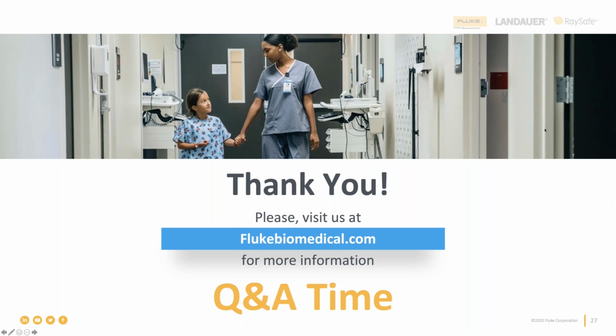The electrodes are what's actually placed on the body, right? So that's the pad with the adhesive gel. And that's really the electrode, and then the lead is what connects the electrode to the patient monitor. So it's the wire, right? So if you think about when you're doing preventive maintenance on a patient monitor, you're connecting that lead to, in our case, the ProSim, for example, and that's how you're going to conduct your test. You're not actually testing the electrode because it's disposable.